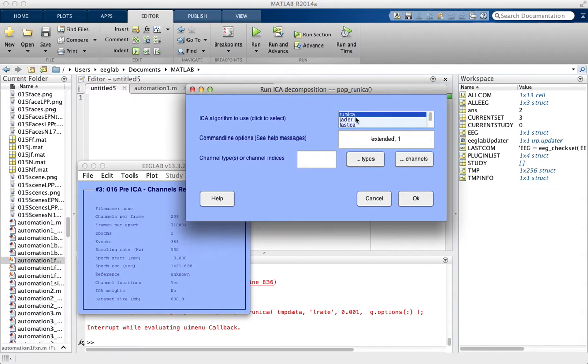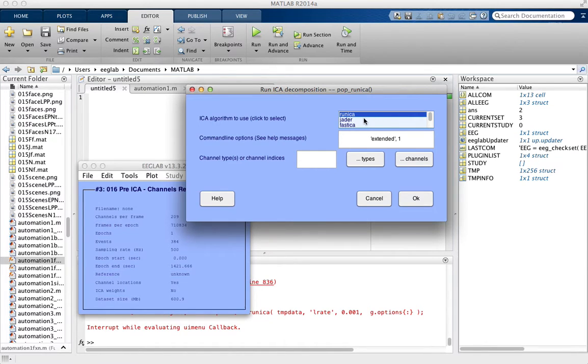We're going to choose Runica, but different ones have pros and cons. You can talk to Dr. Tome about which one you should be using, but Runica is a good one.